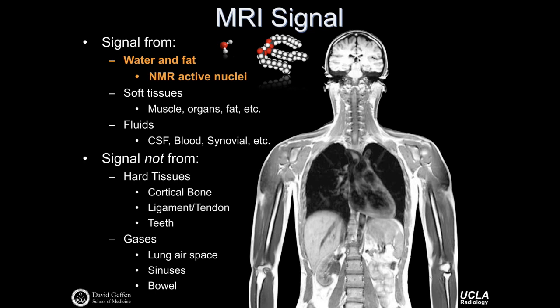And this becomes a strong attribute, as previously mentioned, of MR, that is, the ability to generate so-called soft tissue contrast. Remarkably, MRI can manipulate widely the underlying image contrast, and so in this particular image, you'll notice the blood within the heart is actually quite dark, and that's because of the specific pulse sequence or MRI acquisition that was used to acquire this particular image.